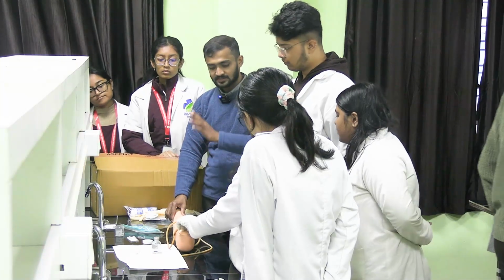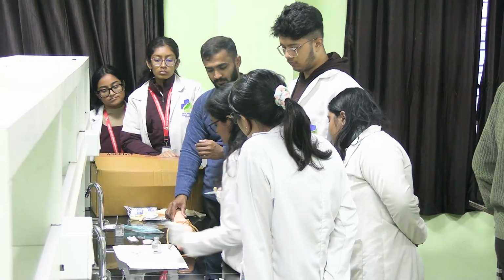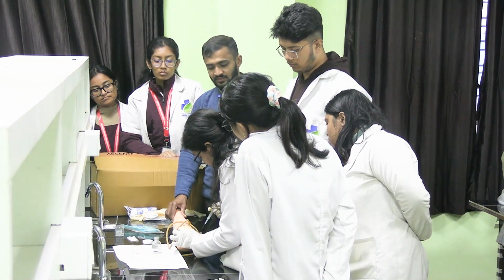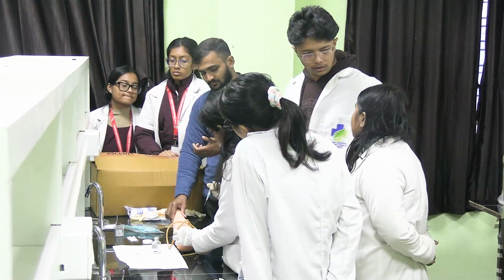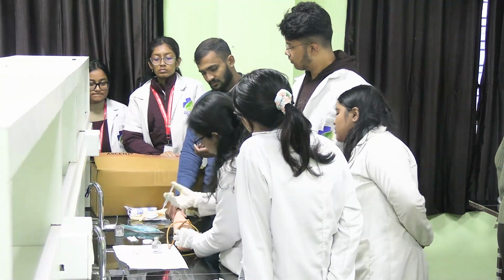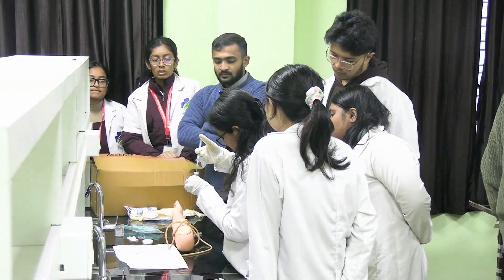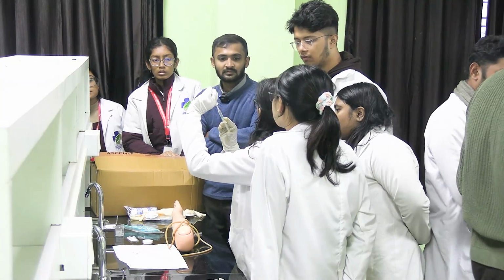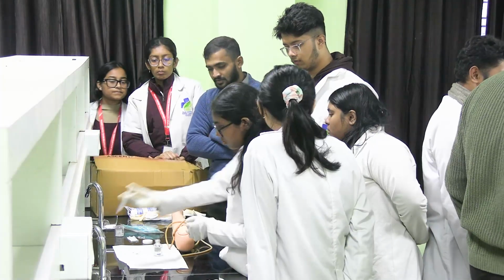For subcutaneous, 45 degrees. Show me. This is which technique? Lifted skin. How much amount will you be taking? 1.1. How much are you introducing? It should be the same.